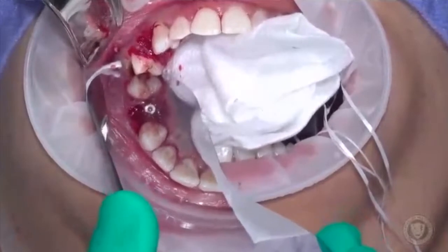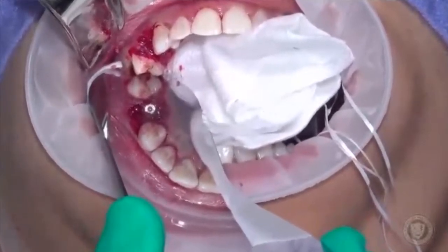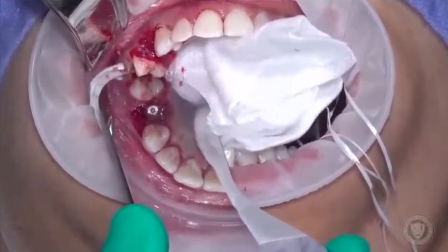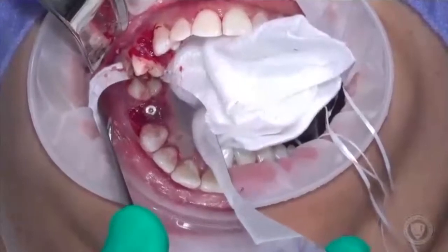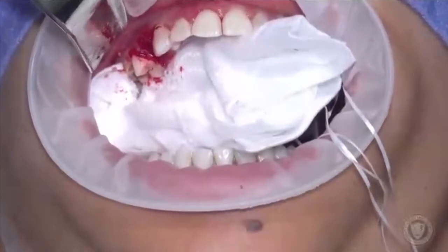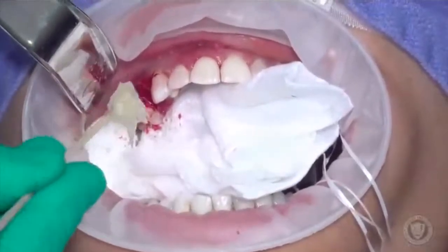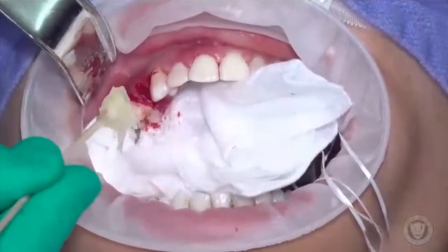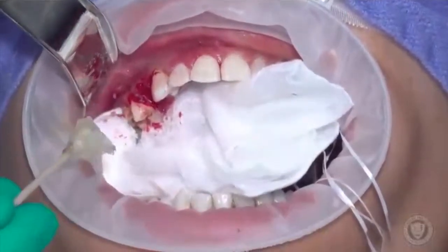Notice I only tacked around the edges and did not float it over the entire graft. That graft will form a clot — from 10 minutes after placement, the initial blood clot will form and really secure that graft. That graft will not fall out. I do not need to put a collagen membrane over it and I do not need to put a suture over it. I haven't elevated any tissue, so that tissue is not going anywhere as long as the patient doesn't chew on that site.